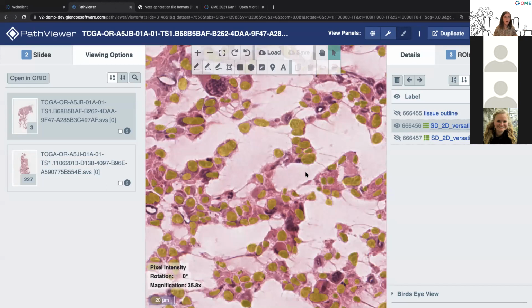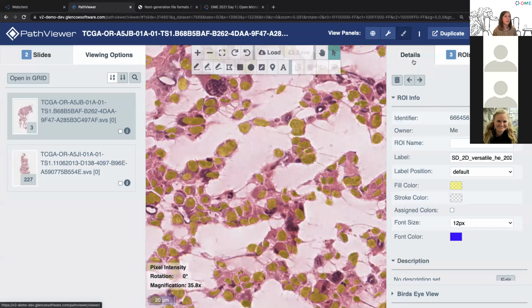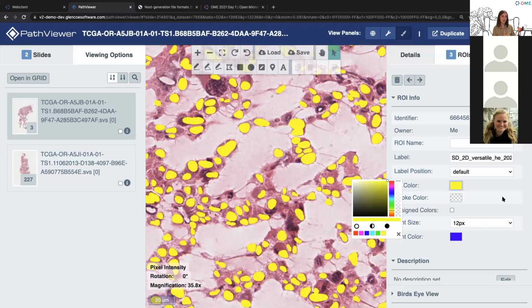Any questions so far about this data and the importance of multi-scales and tiles? Okay, so here we're just looking at a single image, and it appears to be a binary mask now. I can change its opacity to make this a little more obvious. This appears like a binary mask.